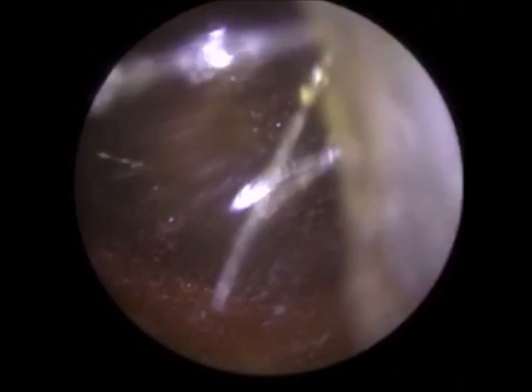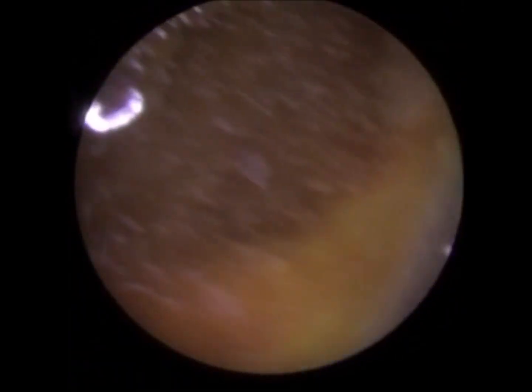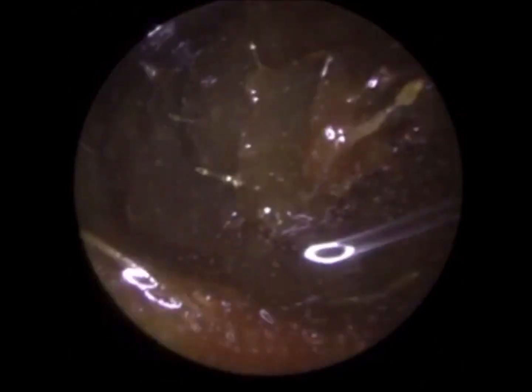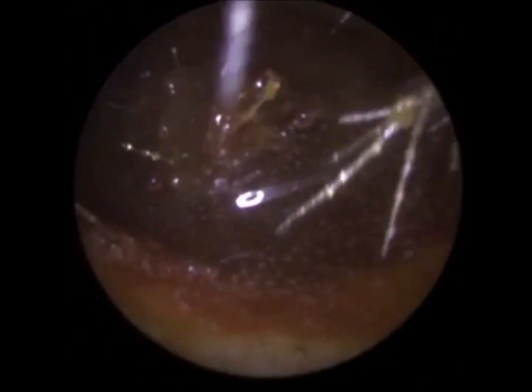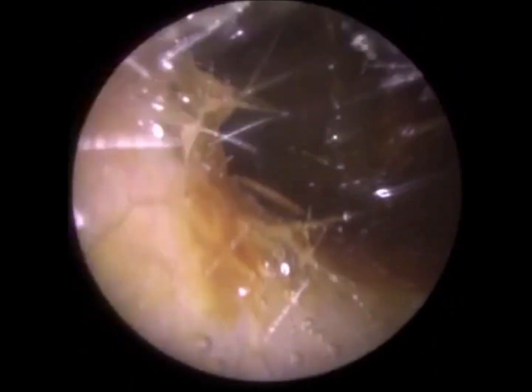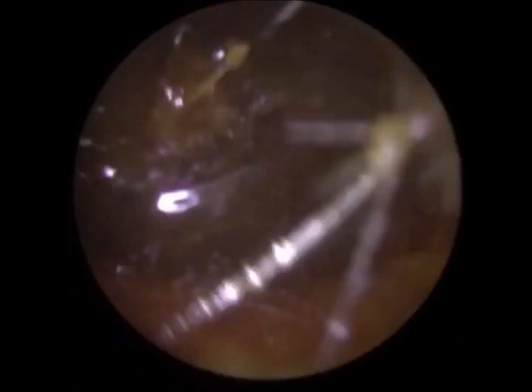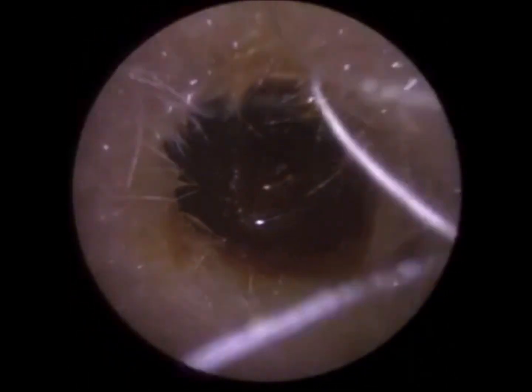We have a client who attended today with bilateral fully occluding earwax. The left ear, which is the one we're performing the procedure on at the moment, was the worst out of the two. The wax was very glutinous, very sticky, and so the suction probe got blocked. The plug of wax extended all the way towards the eardrum — you can just see that when I'm visualizing inside the ear, it's fully occluding. I therefore decided to install some olive oil earwax drops from the offset, just to soften and lubricate this plug of wax to facilitate easier removal.